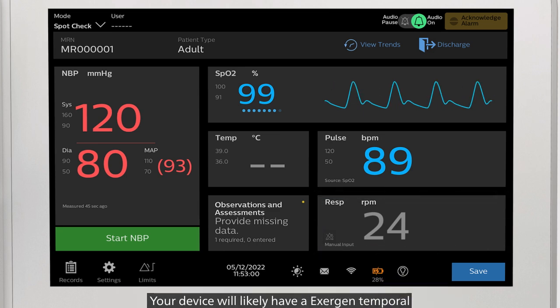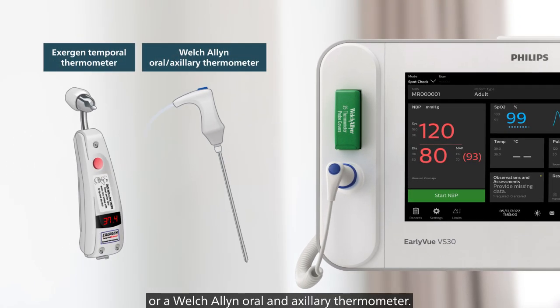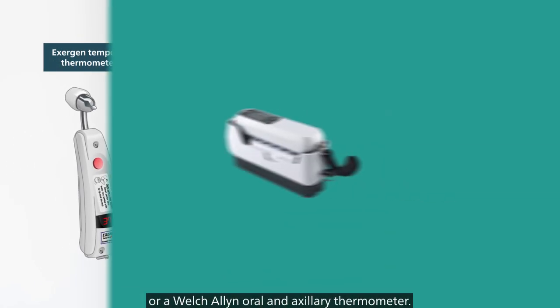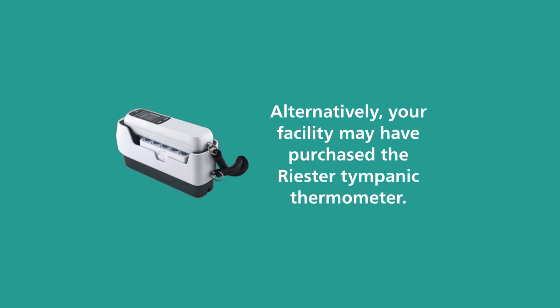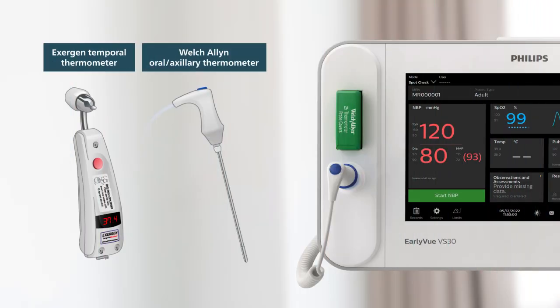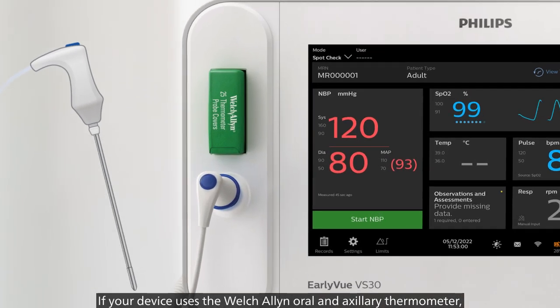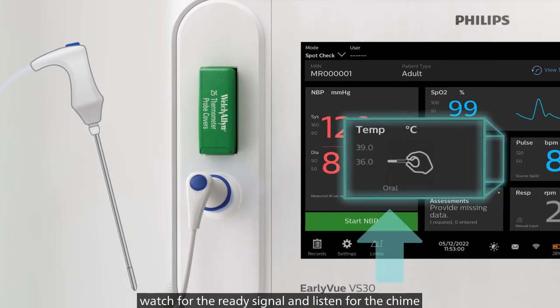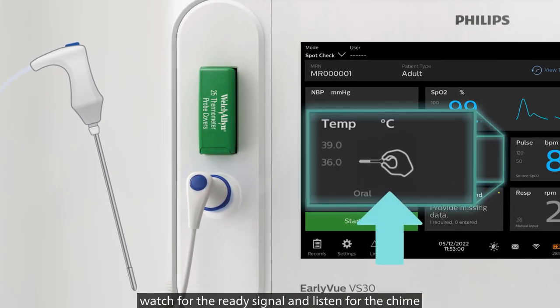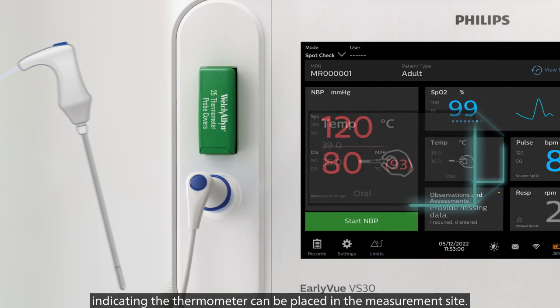Your device will likely have an Exergen Temporal or a Welch Allyn Oral and Axillary Thermometer. If your device uses the Welch Allyn Oral and Axillary Thermometer, watch for the ready signal and listen for the chime indicating the thermometer can be placed in the measurement site.